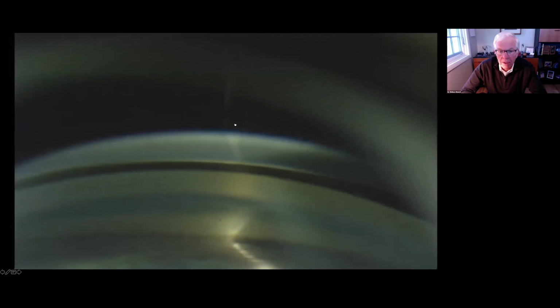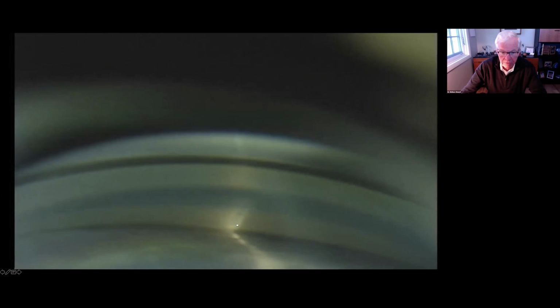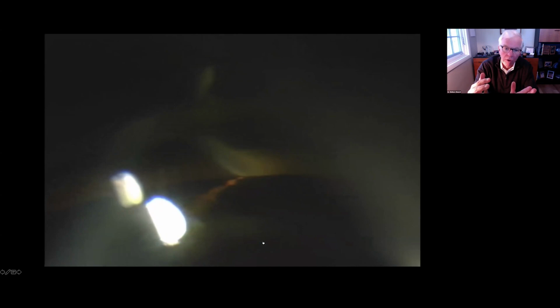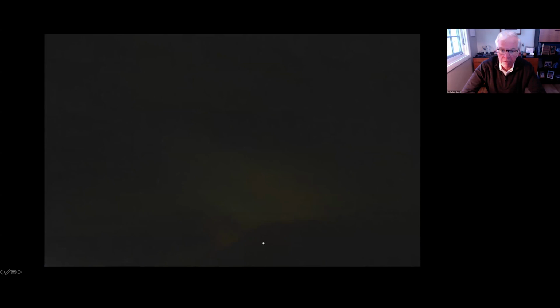This is a little bit off center, sorry about that, but this is an angle. It's very narrow and the beams come together just barely above the iris. So this is an angle that's very, very narrow, but not closed. And this is an angle that's closed. And so the inner and outer lines on the cornea run parallel like railroad tracks, and they never come together. So this is what the corneal wedge would look like in somebody who has a closed angle.